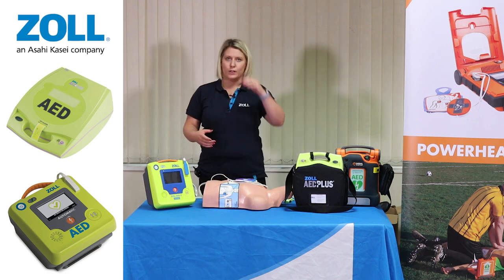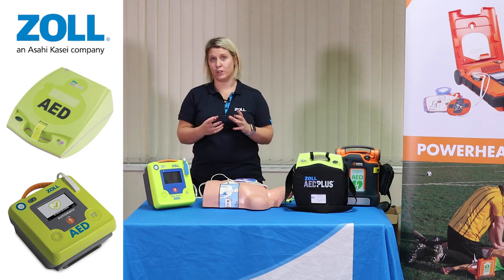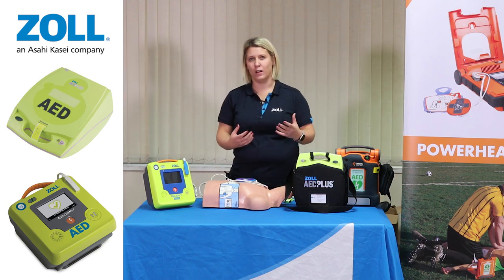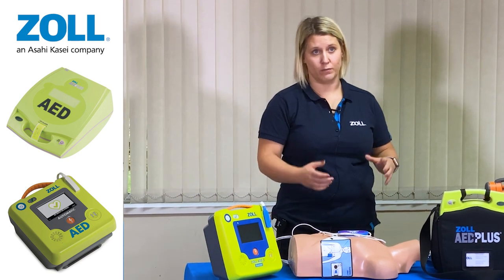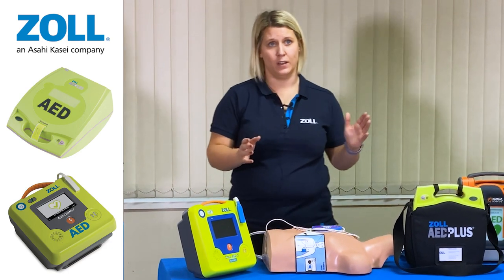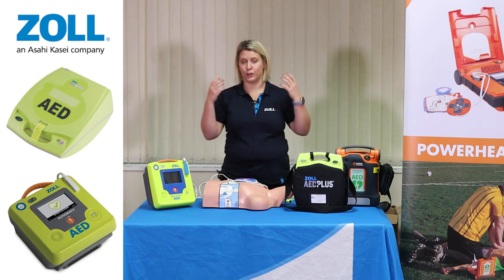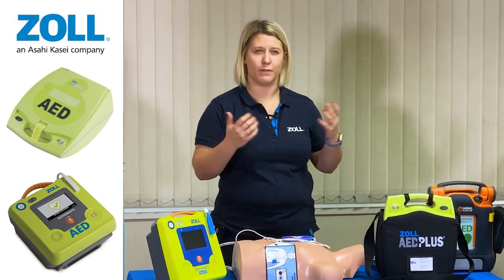What you would also see while using this device is that after the first shock has been administered, we have inbuilt technology called rapid shock. The device will automatically be analyzing to check if there is a shockable rhythm while you're performing CPR, to ensure that when administering the second shock, rather than it being eight seconds from the first shock, it will be between two and five seconds. This ensures we're spending more time on the chest committing to CPR and circulating blood and oxygen around the body, while shocking as quickly as possible in a very safe way.